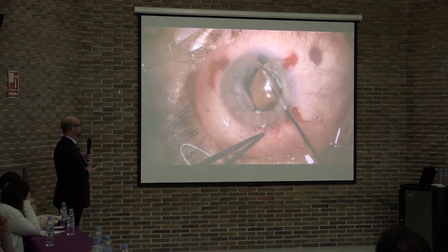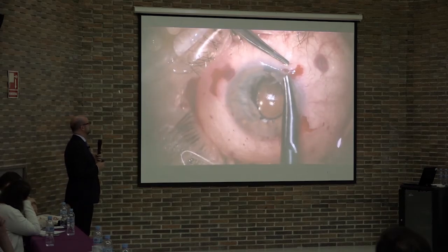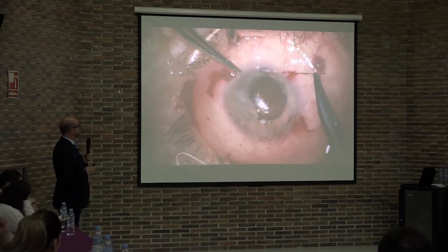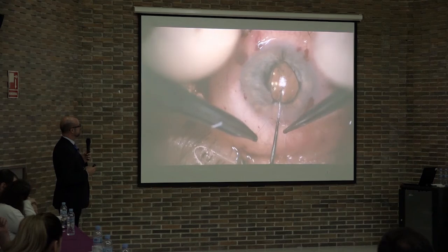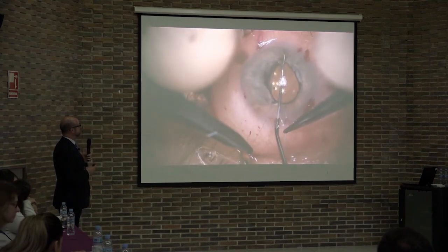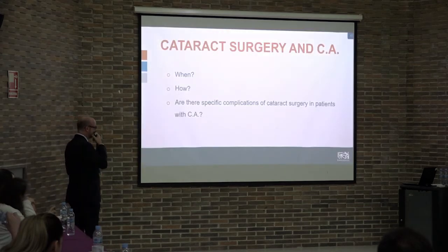It will benefit the patient to have a smaller pupil. So we are closing the remnant hole, which can give some symptoms to the patient, inferiorly, and then the iris is repaired. In this case we were lucky, but in other cases we are not.